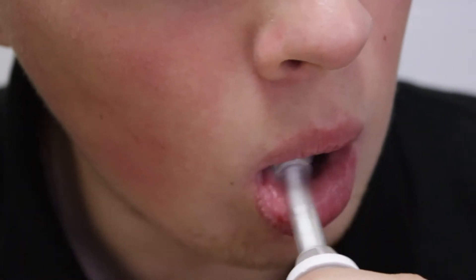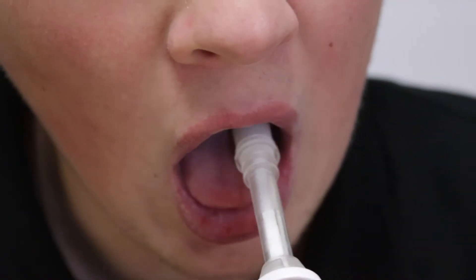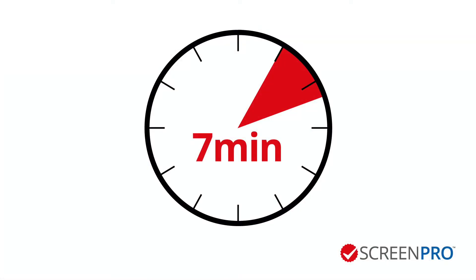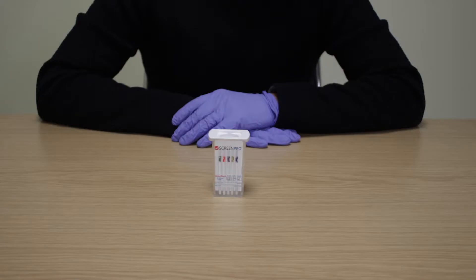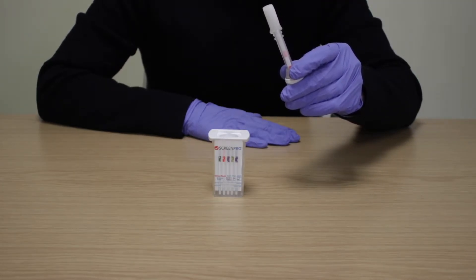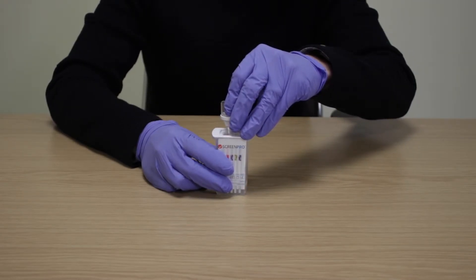Ask the donor to sweep the inside of the mouth, cheeks, gums and tongue several times, then hold the swab in the mouth until a red colour appears on the saturation indicator window. If at 7 minutes the saturation indicator has not turned red, continue to read the test. Remove the collection swab from the donor's mouth and without touching the sponge, insert it sponge-first into the screening device. Push down until locked into place.